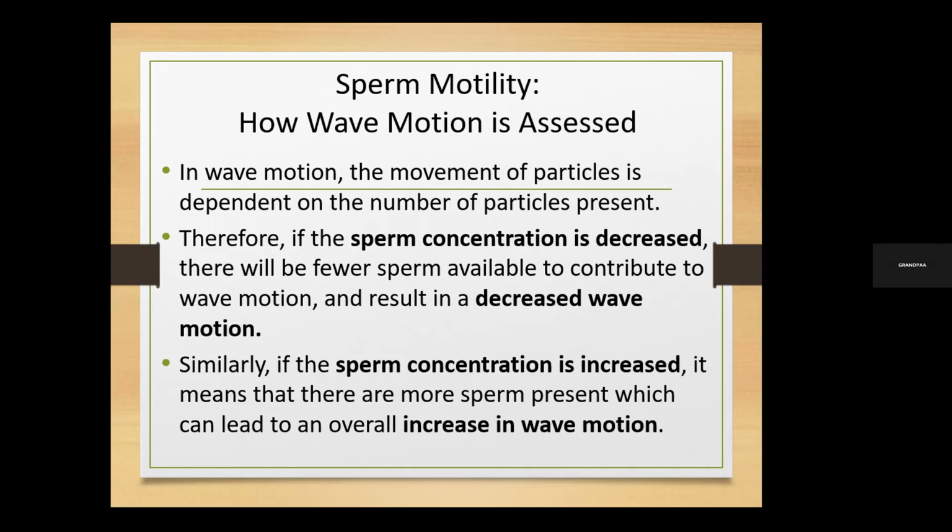If you do the wave motion and motility straight away, it is a combination of two things that you are seeing at a go. Remember we said that you can have high numbers but low motility. But if you are seeing intense waves, then straight away you are convinced that you have the numbers, and at the same time an excellent motility.